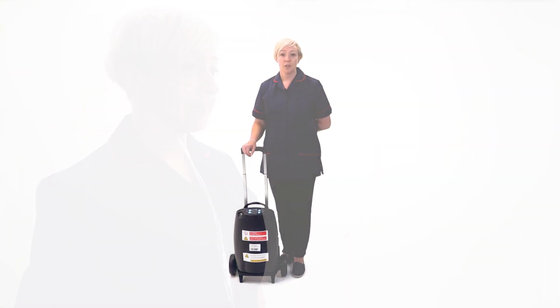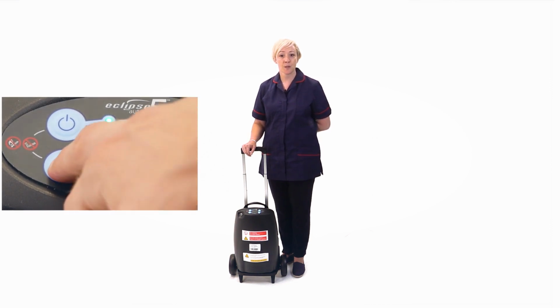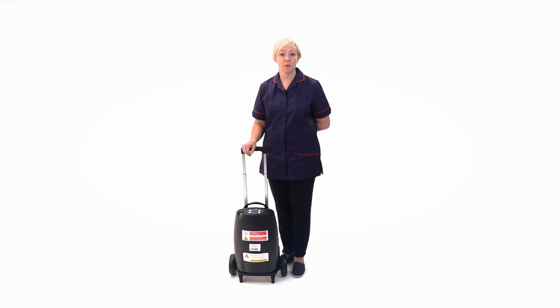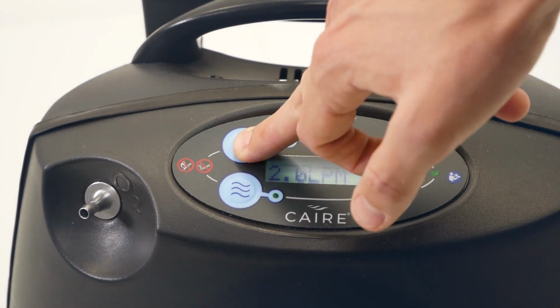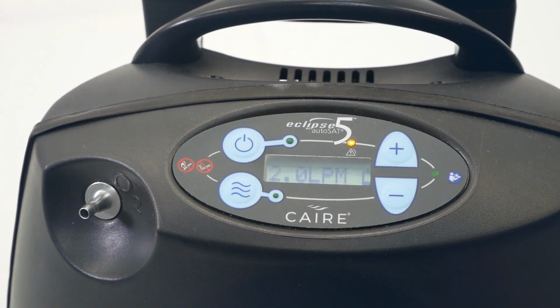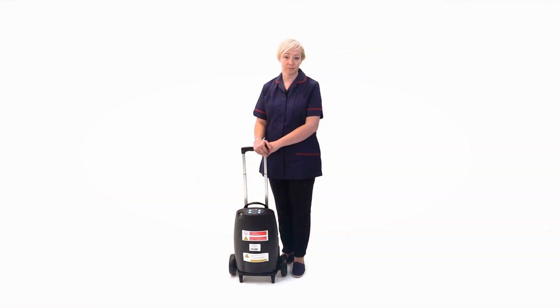Attach your nasal cannula and breathe normally. You can select continuous flow, which will deliver a continuous flow of oxygen. You can also select pulse dose, which will deliver a pulse of oxygen with every breath. Only use the settings as prescribed by your healthcare professional. When you have finished using your device, press and hold the power button to turn it off. When not in use, store the device in a cool, dry location.